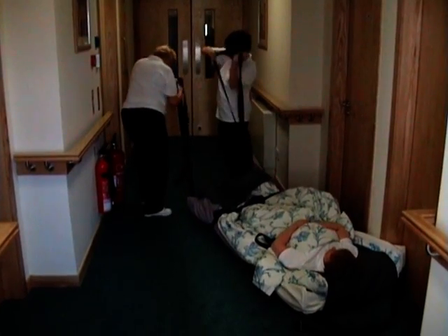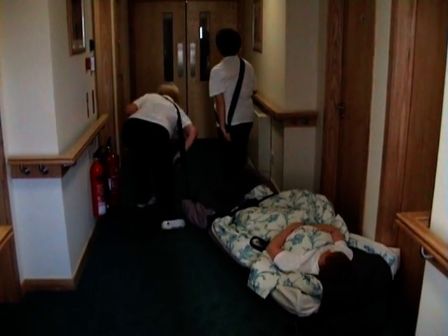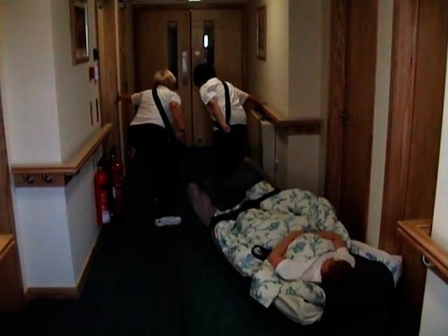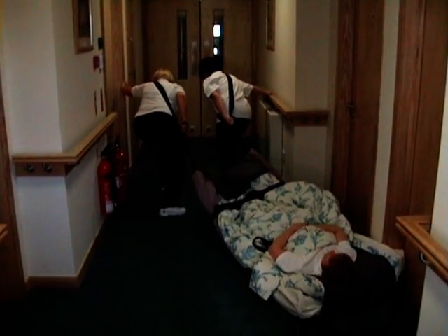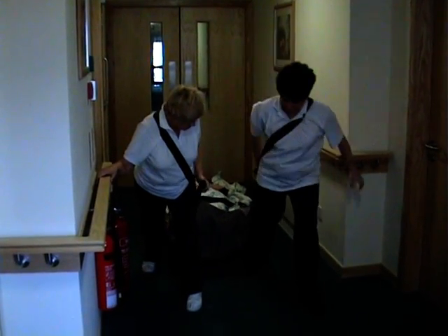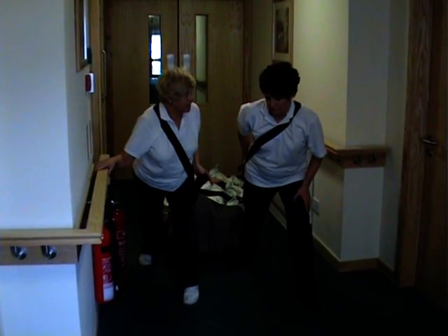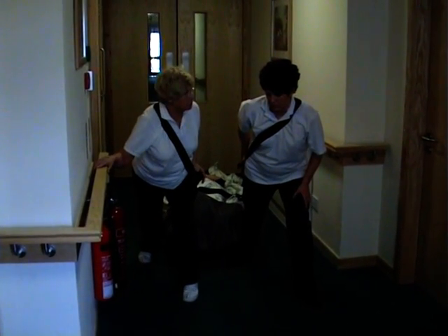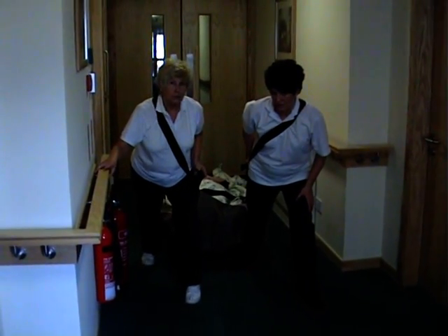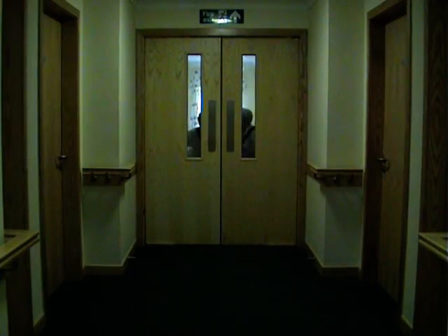To pull the ProPad along a corridor, place the long strap over your shoulder and grasp the short handle with your hand. If you are shorter in stature, place the long strap over your head to the opposite shoulder. Now lean into the straps, taking the weight on your legs. By leaning into the pull and keeping your back straight, the weight of the load is more evenly distributed. If you don't do this, the bottom of the pad will rise off the floor, making the equipment more difficult to handle.